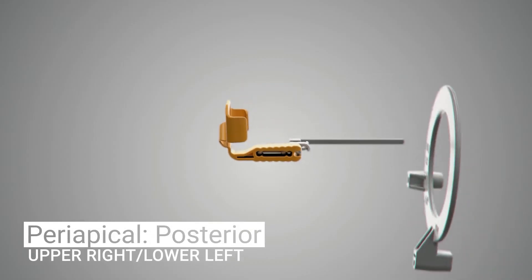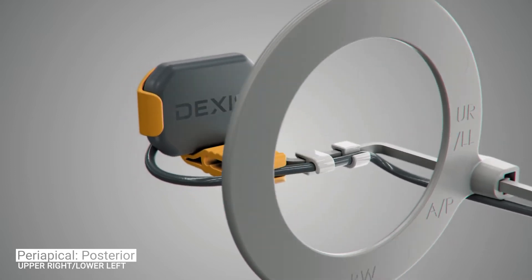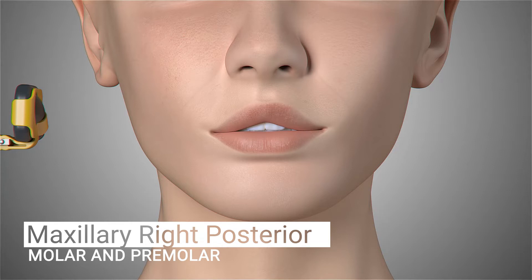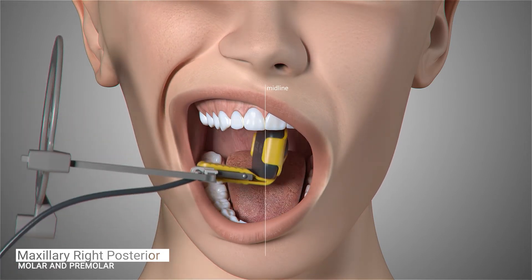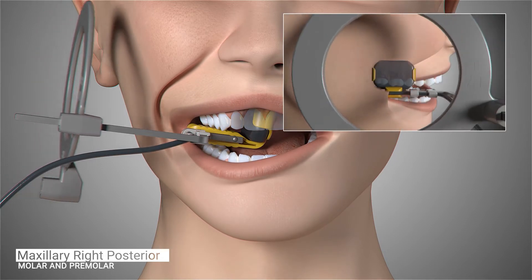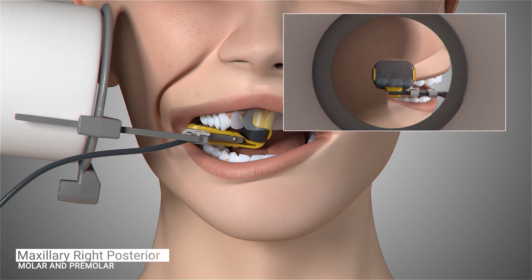The holder setup for this position includes the universal aiming ring, the universal aiming bar, and the yellow posterior horizontal bite block. The first image in our full series begins with the patient's maxillary right molar. Position the sensor in the patient's mouth toward the midline of the palate, parallel to the root of the molar and centered on the first molar. Ask the patient to close and slide the aiming ring as close to the patient's cheek as possible. The cone of the x-ray emitter must be placed flush with the aiming ring and then trigger the exposure.